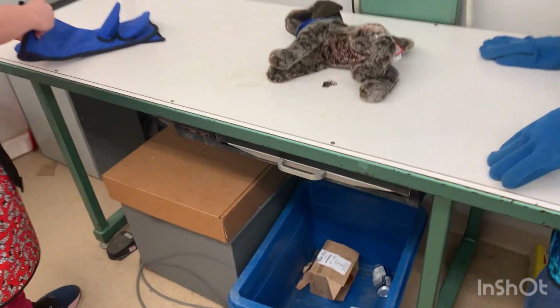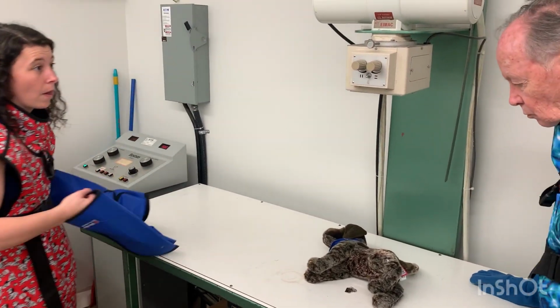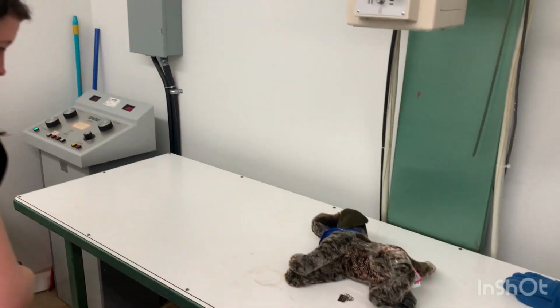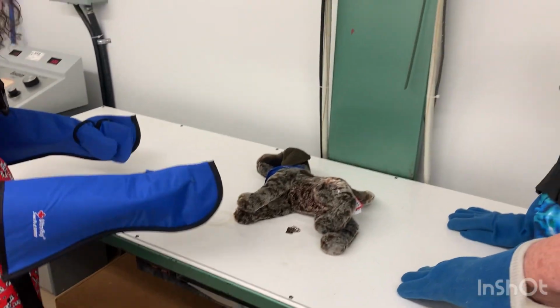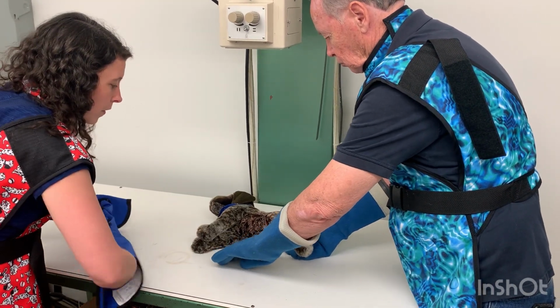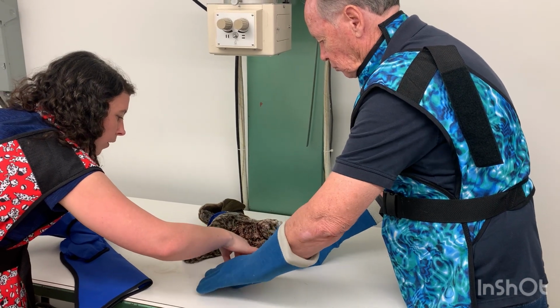And then what we're going to do is we're going to put our gloves on. Making sure this is on here, which it is. And now I'm going to ask my assistant, we need to pull the legs back, please. So we're going to pull the legs towards you caudally, and I'll pull this part right here. And we just want the R to be exposed. Yeah, here we go. That'll work.